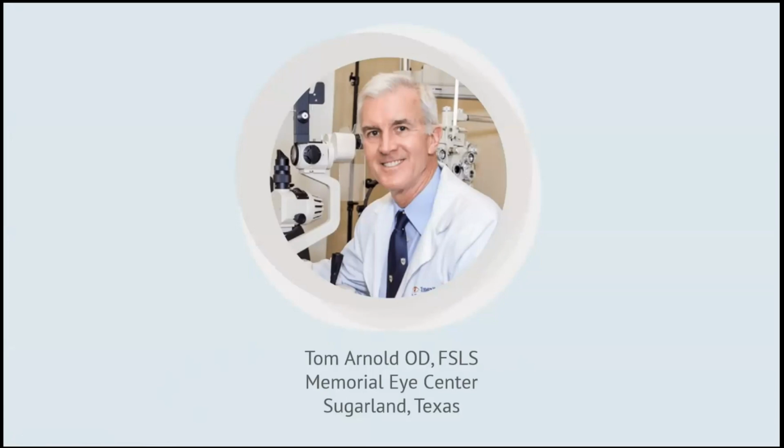And I really think that the ESP made the great leap and went to warp drive with 5.0. So congrats to Rainer and Arnie and all the team. So yeah, I think it's the future. I think it's the way to fit lenses now. And with these new enhancements that Rainer, you're unveiling today, those are the issues.